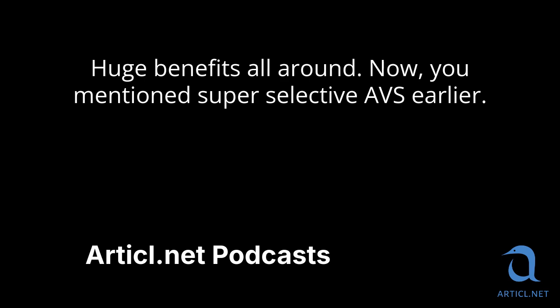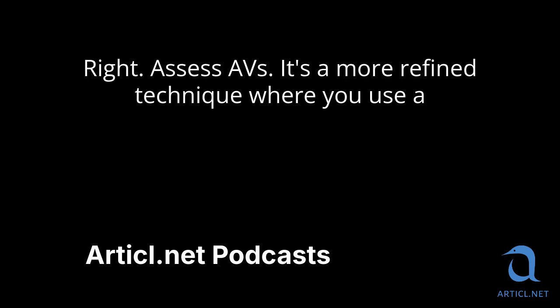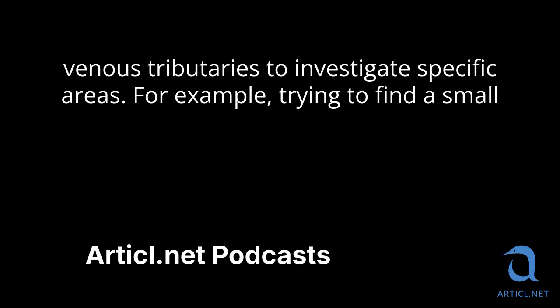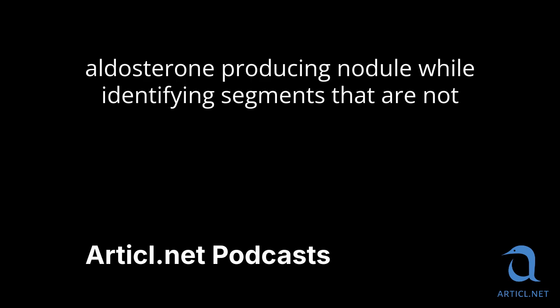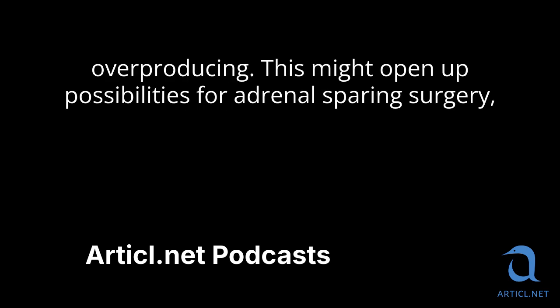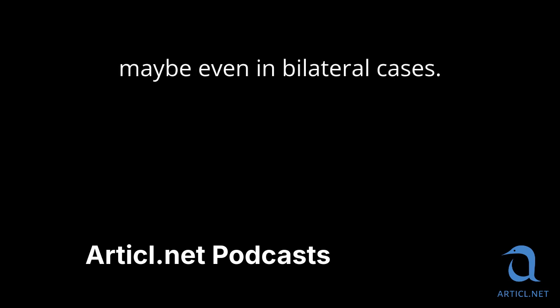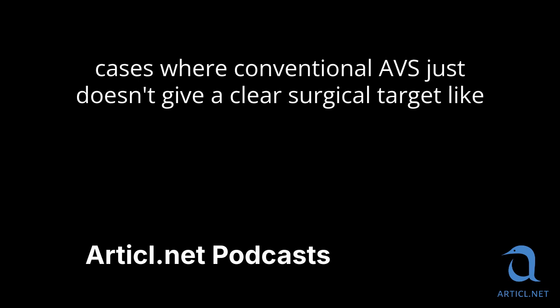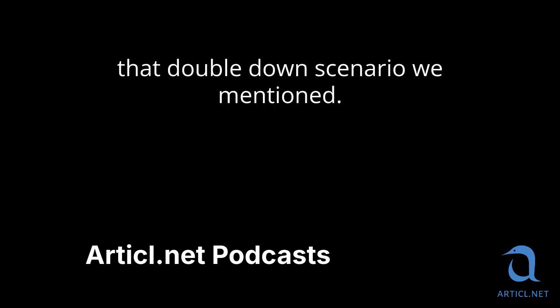Huge benefits all around. Now, you mentioned super selective AVS earlier. How is that different and when would you use it? Right, super selective AVS. It's a more refined technique where you use a microcatheter to go deeper into specific segments within the adrenal gland or its venous tributaries. To investigate specific areas. For example, trying to find a small aldosterone-producing nodule while identifying segments that are not overproducing. This might open up possibilities for adrenal-sparing surgery, maybe even in bilateral cases. Very sophisticated. It is. It's particularly useful in known bilateral PA, or those really tricky cases where conventional AVS just doesn't give a clear surgical target, like that double-down scenario we mentioned.